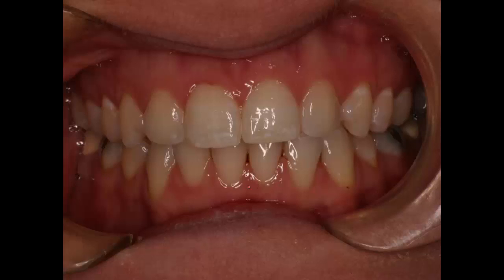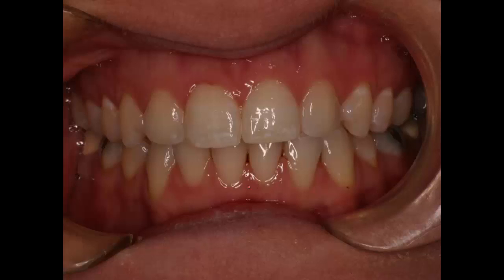I'll go back here and show those teeth. If you just looked at this patient right quick, there wouldn't be very many dentists who would immediately say, 'You've got cuspids, you don't have any lateral teeth in here.' They really recognize that. So just trim some teeth that have been extracted if you're concerned about being able to trim them up good. And some people are not artistic enough to really do this, but it is not a difficult thing to do.